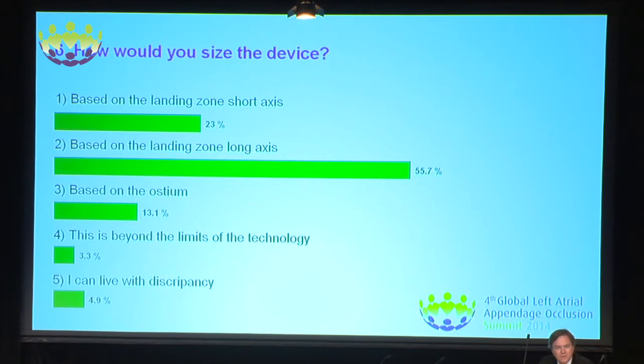Okay, the truth is that I certainly use personally a mixture of all of these, although, as I mentioned before, I've taken more and more concern of the ostium, so that if I have a very severe funnel and I didn't have the long axis images, I probably would have taken close to a 30 anyway, even though I was getting an 18 or a 21 in the short axis.